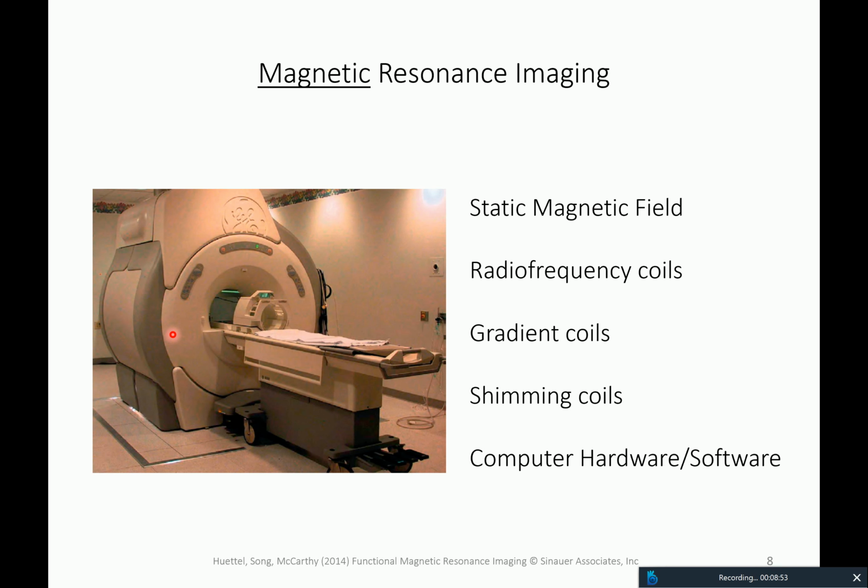The first thing is the magnetic part in it. As you, I guess, know, these magnetic resonance imaging devices are, of course, also available in hospitals, and actually that's their main function. Their main function is not to do fMRI experiments, but to do clinical diagnostics.